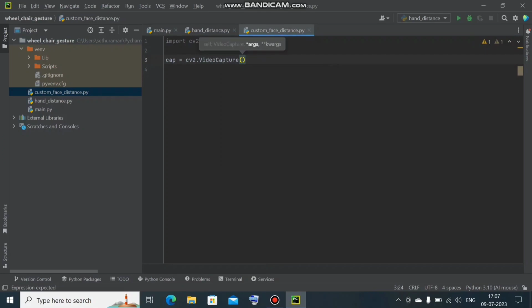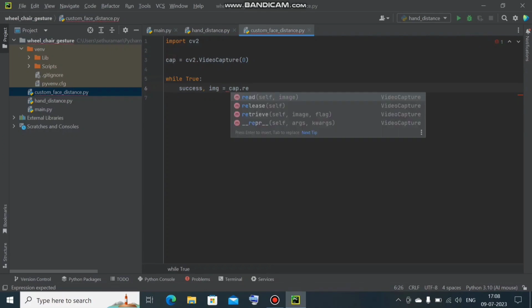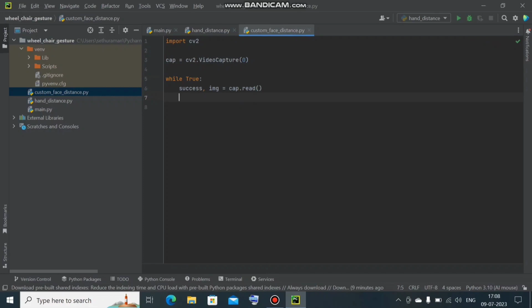If you are using an external camera, you need to put 1, but I'm using my local laptop camera, so it is webcam 0. It is my PC's default webcam, so it is 0. Then inside the while loop, success comma image. Image is the variable that reads the cap variable. So in the name of image, our video is going to be read.